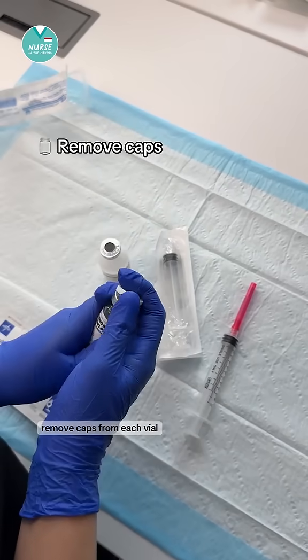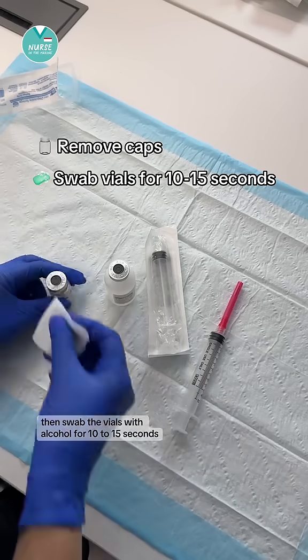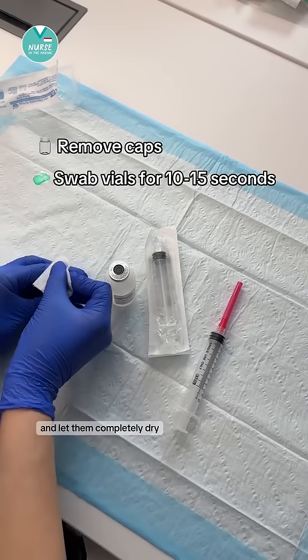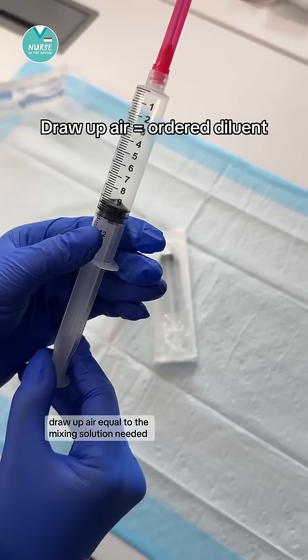Remove caps from each vial, then swab the vials with alcohol for 10 to 15 seconds and let them completely dry. Without removing the needle cap, draw up air equal to the mixing solution needed.